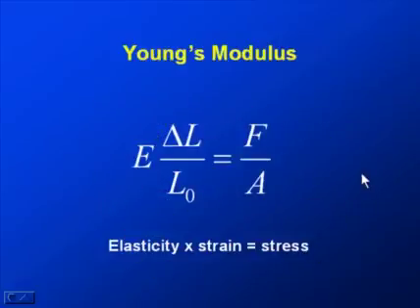Now, this is a fundamental equation that governs elasticity imaging. It's the Young's modulus given by the letter E here, and it turns out that the Young's modulus is related to stress over strain, where strain is the change in size of an object or a rod or a spring, whatever it is you're looking at, relative to the original length. So we are looking at changes in size, displacement essentially, and then F over A is force over area, so it's the stress. So what it tells you is that the elasticity is the stress divided by the strain.